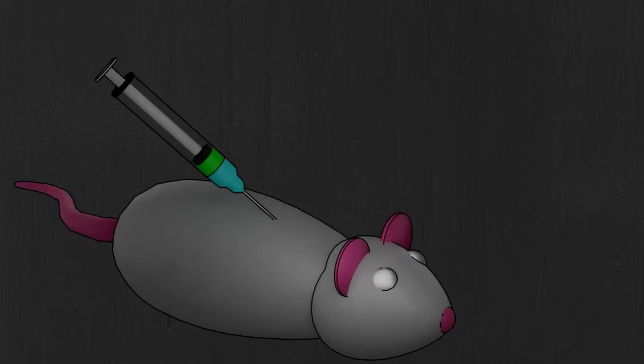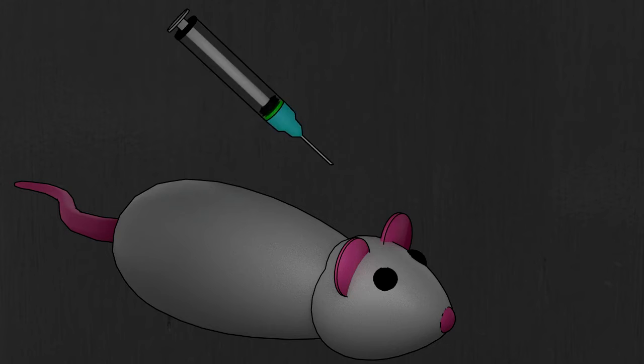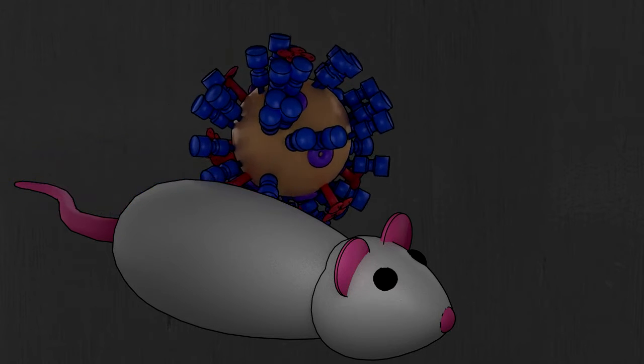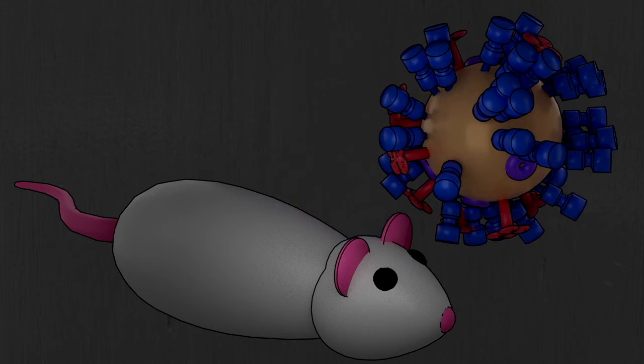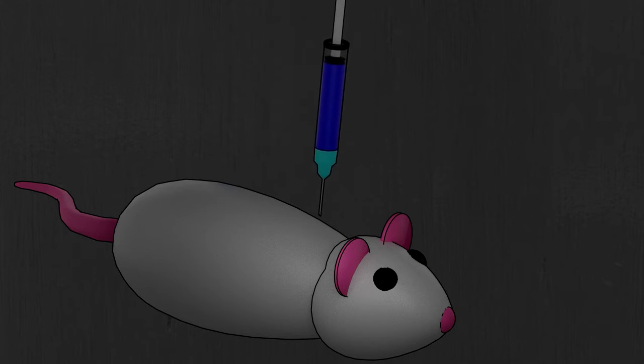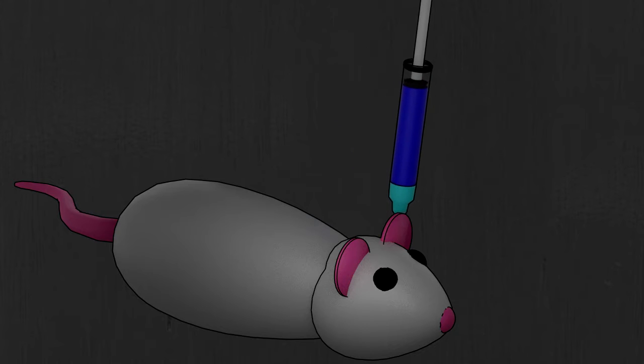mouse. To begin RNA sequencing, mice are sedated. A special strain of the flu, called a murine-adapted influenza, has been created to mimic human symptoms in the mouse model. A specified concentration of this virus, called the viral titer or viral load, is suspended in an aerosol inoculum and administered to the unconscious mouse through its airways.